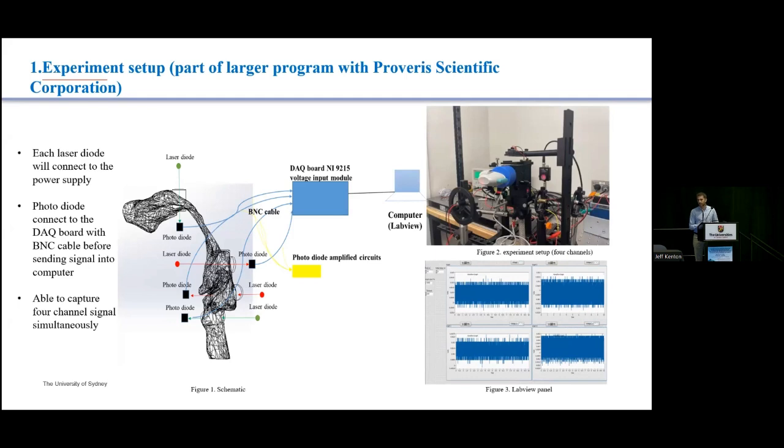What we're looking at is trying to understand how we can use a relatively simple setup to track the dynamic movement of an aerosol through an airway. The way that we've dealt with complex airway geometries in the past, we've published some work looking at PIV and flow fields in airways, is that because the airway geometry is so complicated, you have to use refractive index matched fluid so that you can see through the airway. Obviously, that means it becomes completely unrealistic. You can't really deliver an aerosol through it, so you're only looking at the flow.